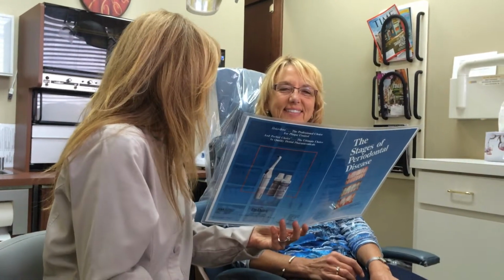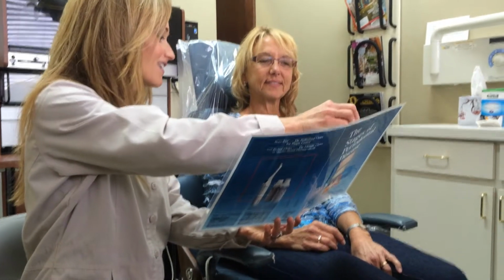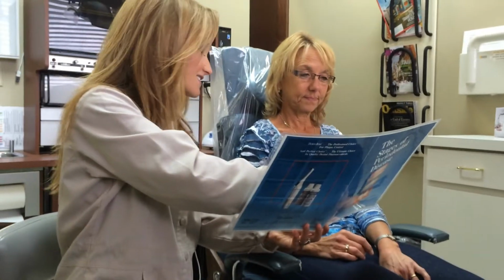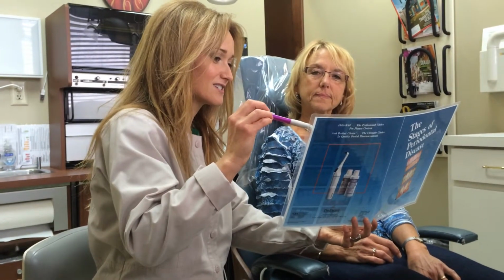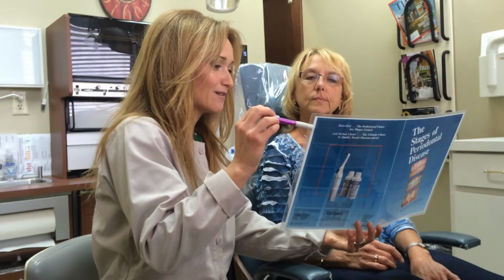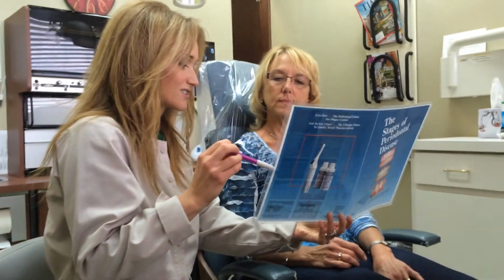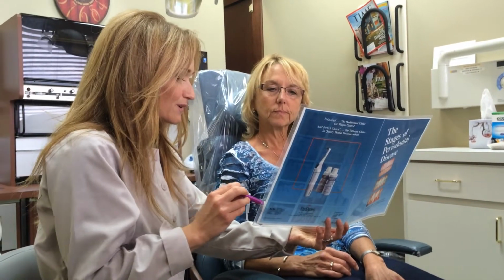Katie, I'm going to show you the screening process that we're going to be doing today, and it goes from healthy all the way down to advanced disease. Why the x-rays that we just finished taking are so important is we can actually see the bone surrounding the tooth. Can you see that there? If you follow this bone height over time, you can see it dropping all the way down there. Wow. So that's really what I want you to understand.